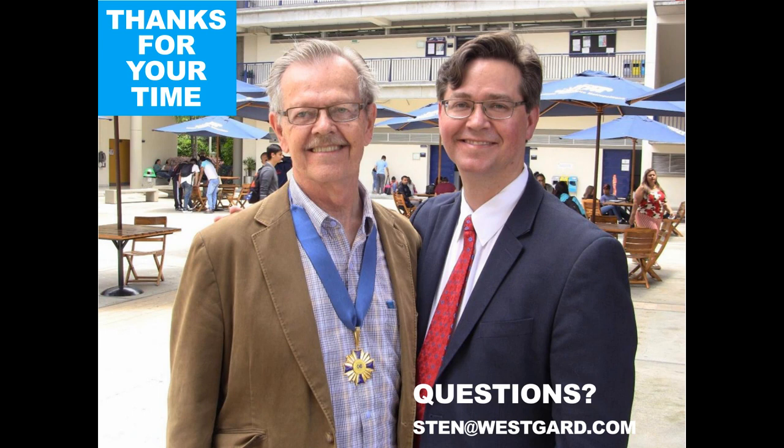So ideally, we would like to follow that when we go to Sigma-metrics. We want more than 1 month of data. So we would like to do the cumulative comparison, and that might cover 2 months, it might cover 6 months, but that long-term performance data gives us the best picture of how the method is performing overall. So we have our best picture of bias by comparing your observed cumulative mean versus the peer cumulative mean.